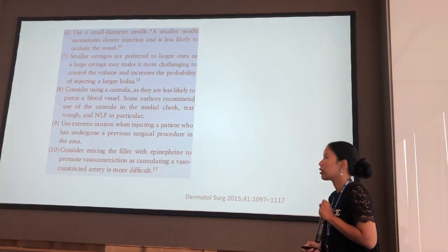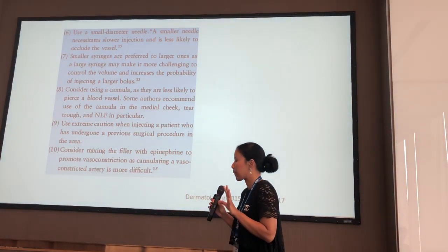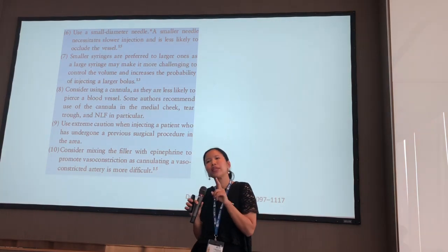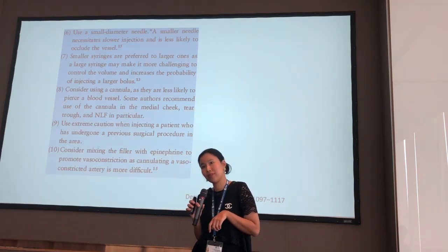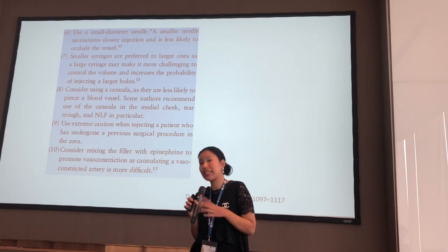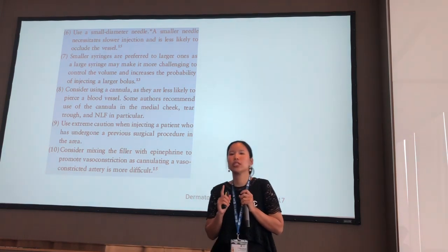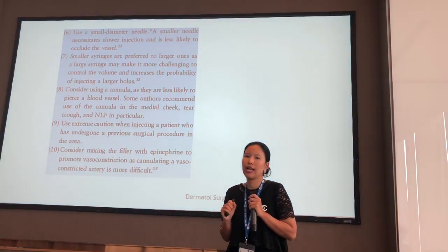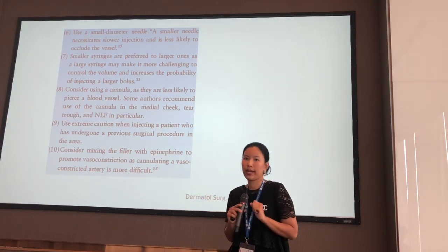And considering the cannula, this is also a really popular pitfall. Do you think that cannula is safer than needles? The answer is yes and no. It depends on the size of the cannulas. If you use a small size cannula, it can act as a needle, or even worse, because it can cannulate the vessel, right? So please be careful when you use cannula, and it's safer if you use a bigger cannula than a small one. That's the key.